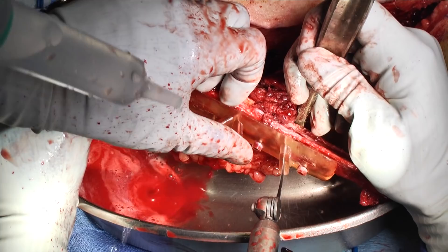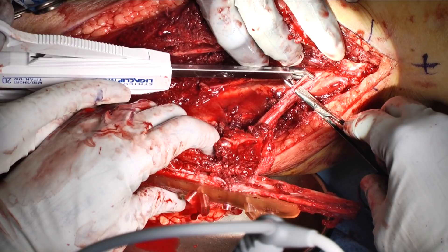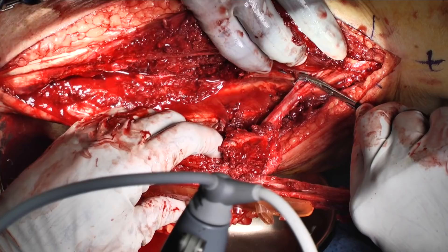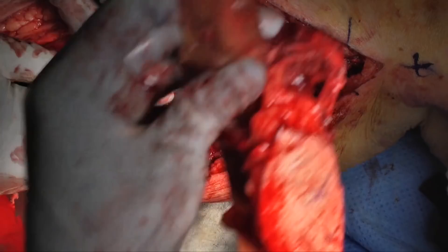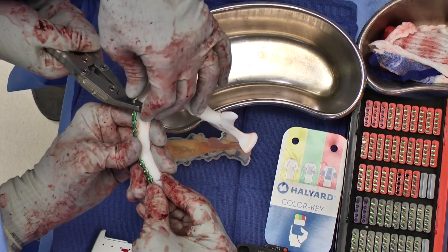The proximal bone not going to be incorporated into the flap is removed, which allows lengthening of the pedicle — the more proximal bone removed, the longer the pedicle becomes. After the flap is contoured in situ, the vessels are divided. We place two clips proximally and distally on each of the venae comitantes, and two clips distally on the peroneal artery, then clamp and tie the proximal peroneal artery in the patient. The two clips ensure we know which vessels will be used for anastomosis, as this can be confusing once the flap is detached. The flap is placed into a kidney basin with a wet saline sponge and taken to the back table.